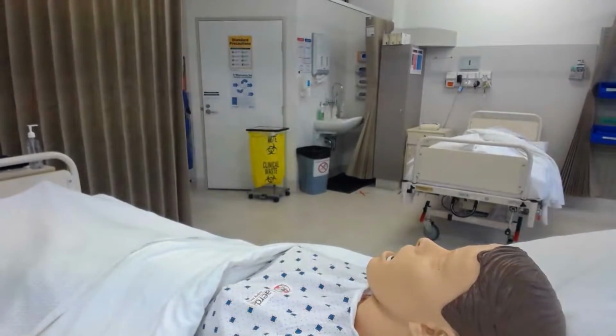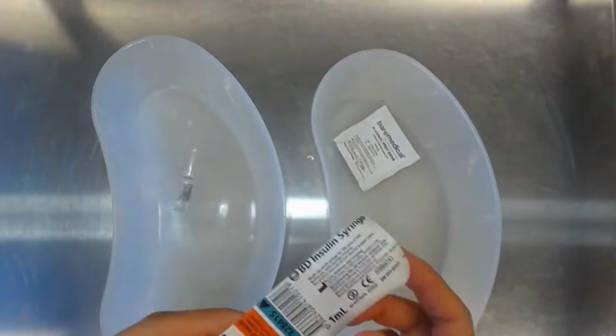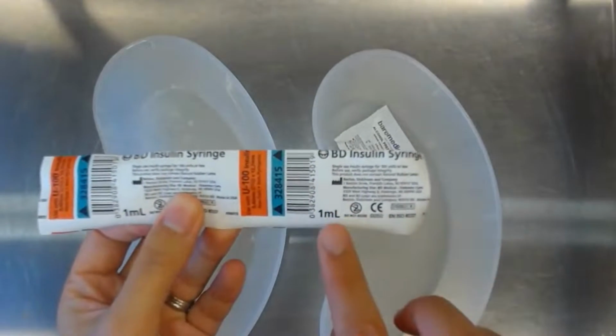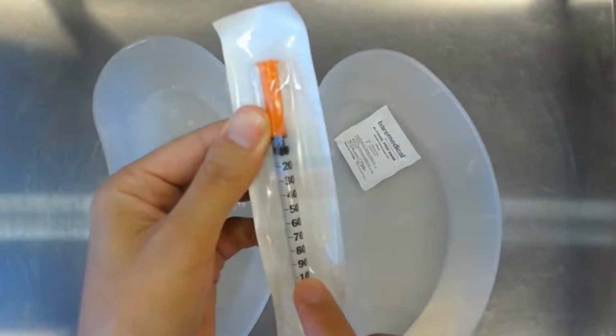Preparing the injection, collect the appropriate equipment. This syringe has a subcutaneous needle already attached. Because it's already attached, we're going to use this to draw up the medication from the glass vial.